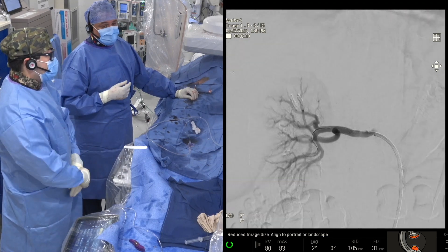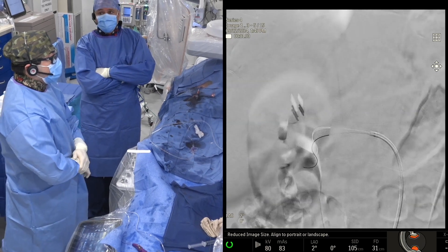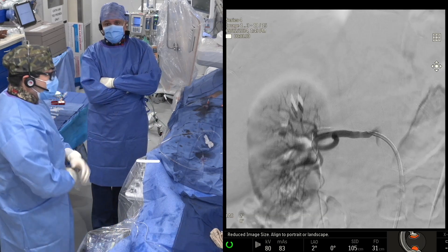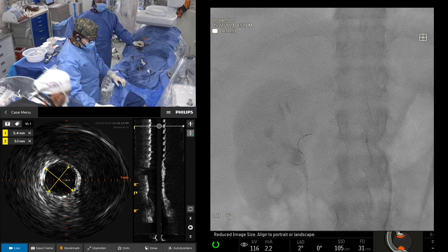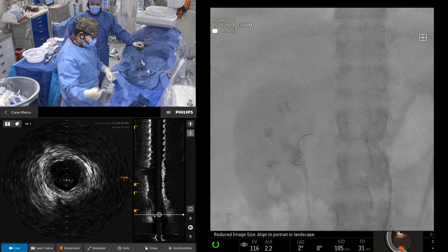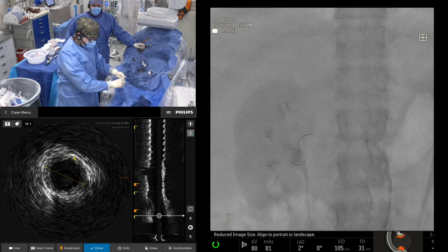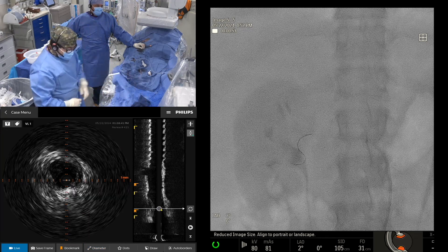You can do a qualitative vascular assessment by measuring, or an eyeball sizing of the artery, which has been done for years. But what we're planning on doing here, because it's available in our lab — though it's not 100% necessary — is intravascular ultrasound, which will give us the size of the artery. Based on my assessment, I would use a 6-millimeter balloon. IVUS measures it at 5.4, so in my opinion a 6-millimeter balloon is the right size to ensure apposition of the device against the vessel wall.